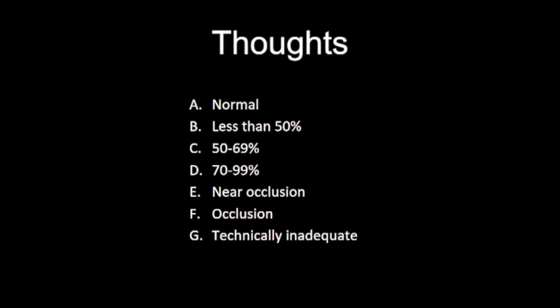Okay? So same thing. Let's see if I can get two people to vote for this one. What do you think, John? You think I can mobilize double my possibilities here? Easy, okay. A, anybody, A. B, one B. C, D, E. I got 1, 2, 3, 4. I got a lot of E's. Oh, and little Johnny. F. And G, anybody G? Okay.